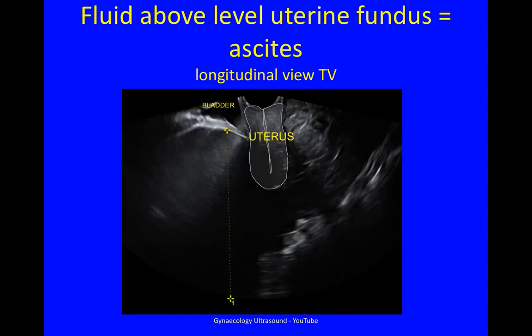This is a longitudinal view of the pelvis seen transvaginally. There's bladder here, uterus here, pouch of Douglas here. When the fluid in the pelvis extends beyond the level of the uterine fundus, it is now ascites.